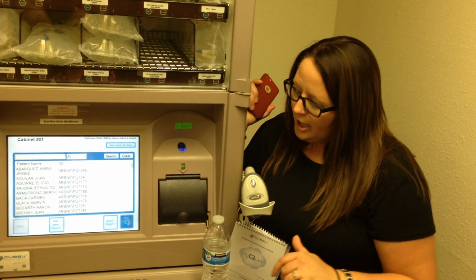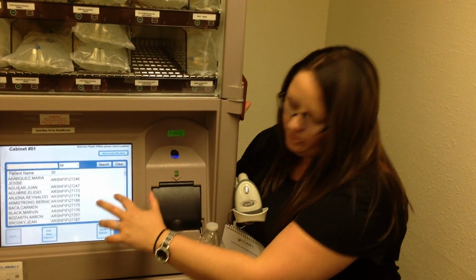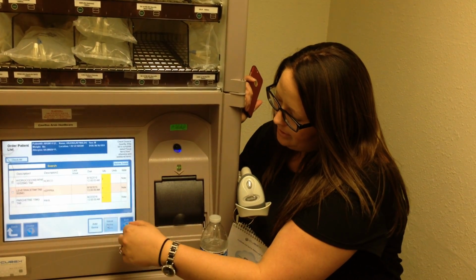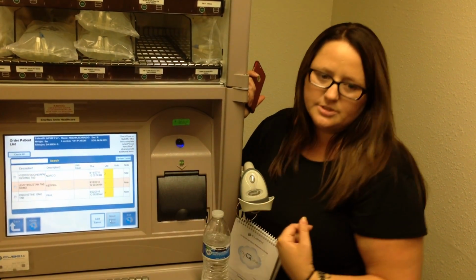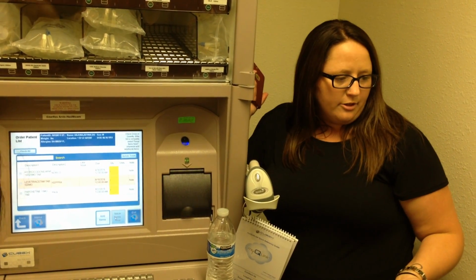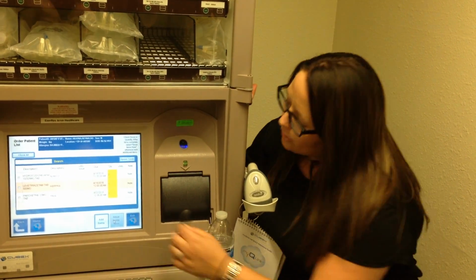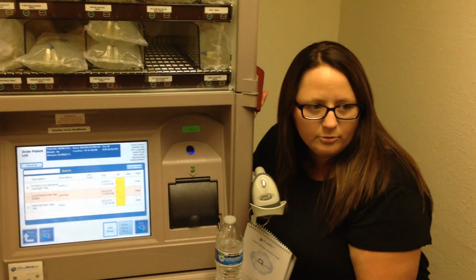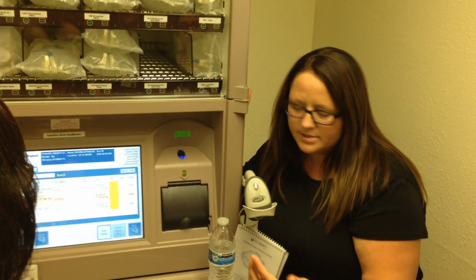Just a few letters. What you will see with most patients, when you select them and hit issue return, is that all the patient's items are going to show up automatically. Okay, is this how the other CubeX was? Okay, so you'll have all of the items on here. If you hit no, it'll tell you more about what the script is.